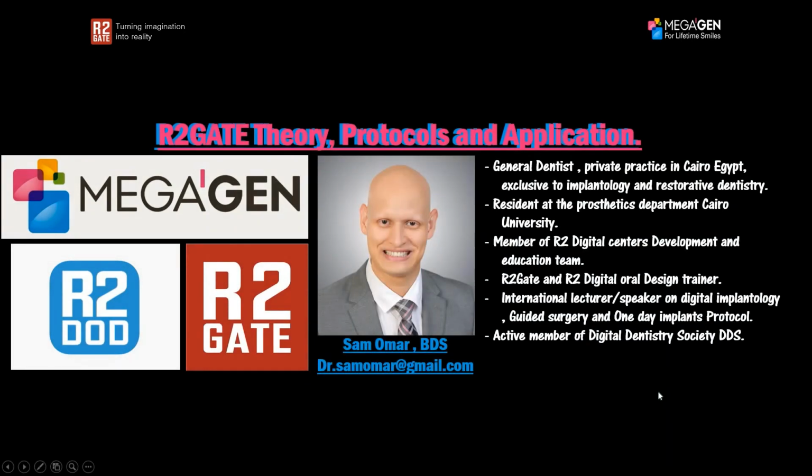This is the end of my presentation. Thank you so much for joining. I hope the presentation today was informative enough. We tried to make sure that we incorporate as much information about the R2GATE system here for you today, and we really talked about everything that you might need to get started with your first case. I was very pleased to introduce the R2GATE system to you.